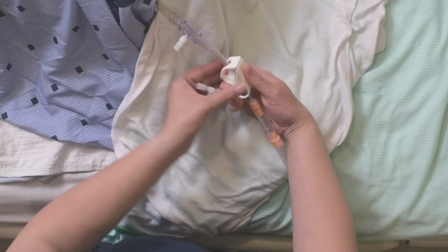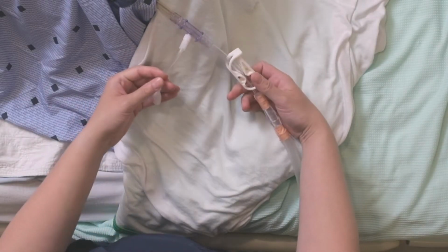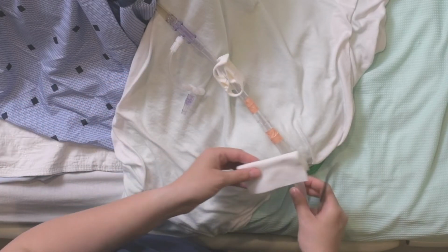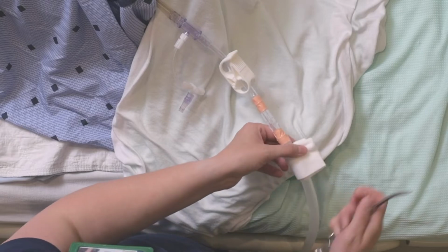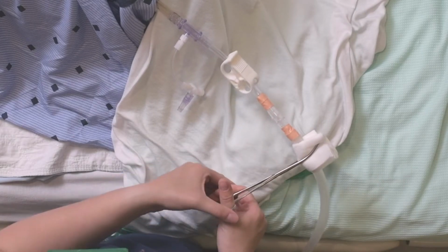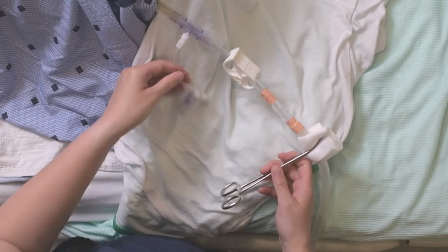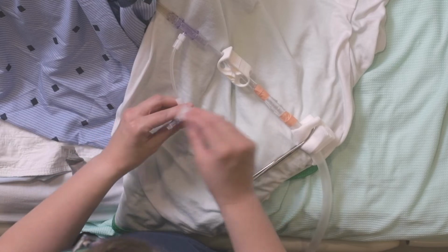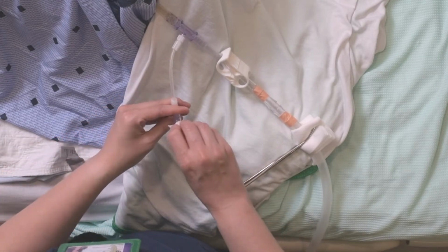Clamp the thalquick chest tube adapter with the white clamp and clamp the chest tube under the thalquick chest tube adapter using a hemostatic clamp and a 4x4 gauze. The medication could leak into the drainage system if only the thalquick chest tube adapter is clamped. Clean the needle-free connector for 15 seconds with an alcohol swab and let it dry.